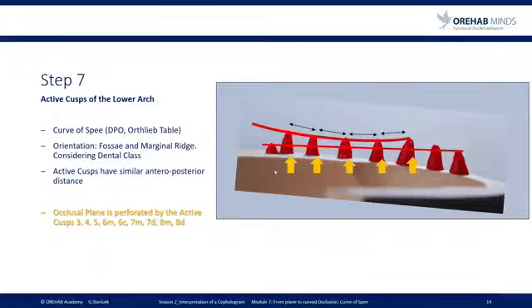active cusps have a very similar anterior-posterior distance. So there are geometrical principles of occlusion which already can be seen in this stage of a wax-up.